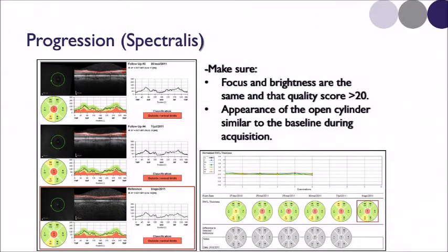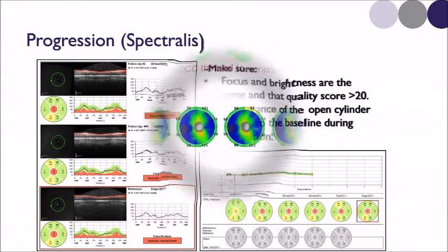This is what the serial analysis looks like on the Spectralis OCT from Heidelberg. They're very good data, but they don't give you stats, so you just have to do the comparison in your head.